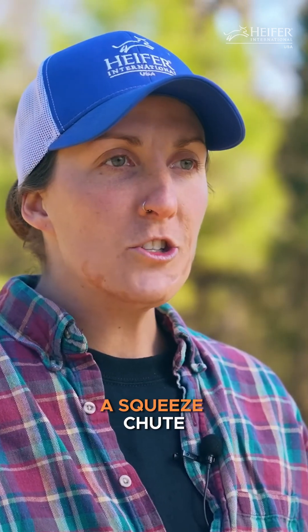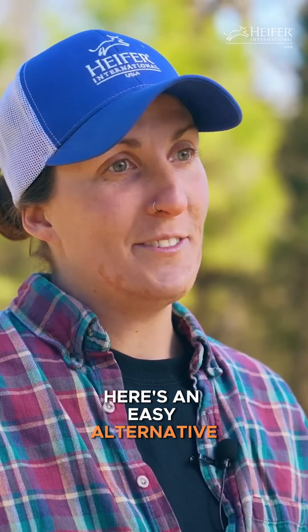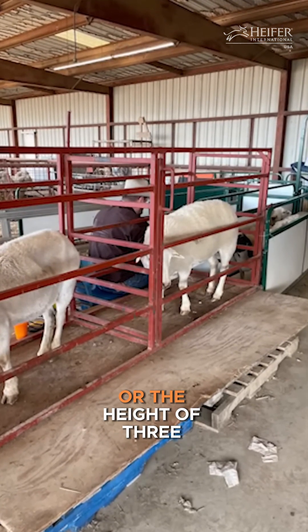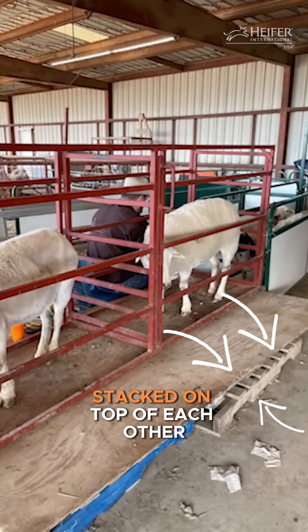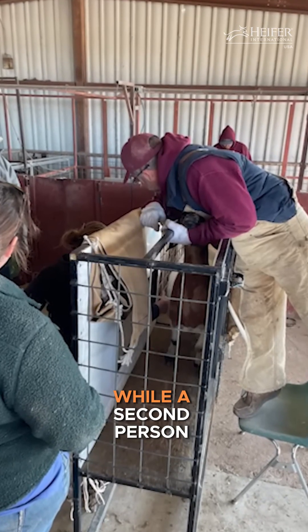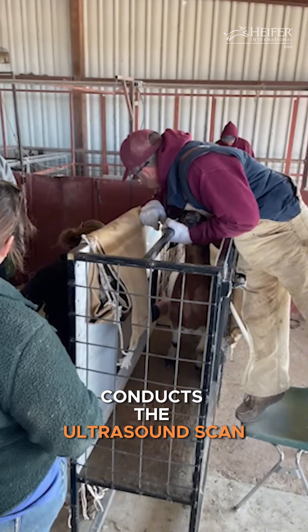If you don't have a squeeze chute, here's an easy alternative method. Choose an area that's elevated about two feet off the ground, or the height of three pallets stacked on top of each other. Have one person hold the ewe steady while a second person conducts the ultrasound scan.